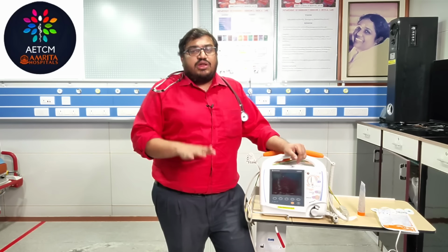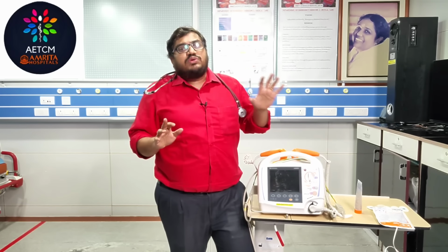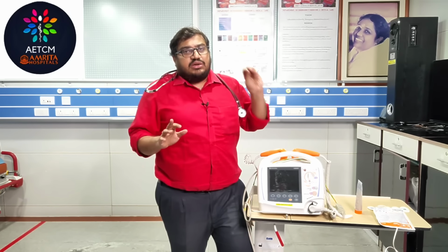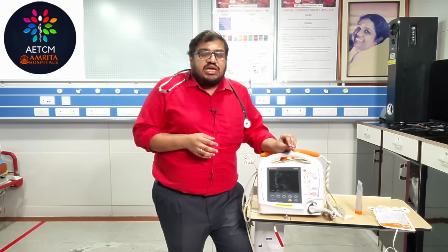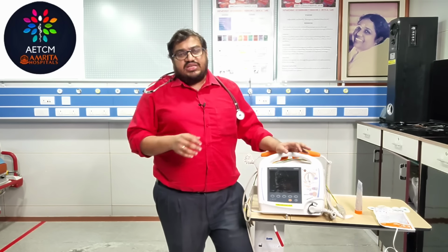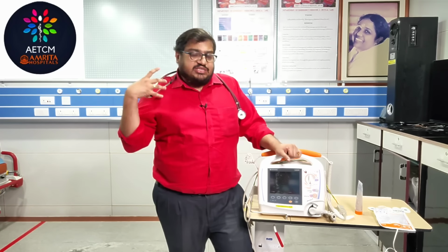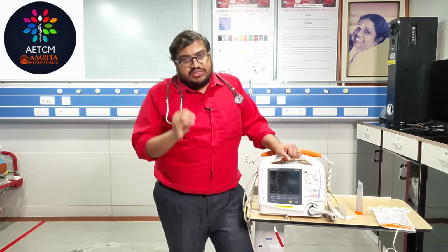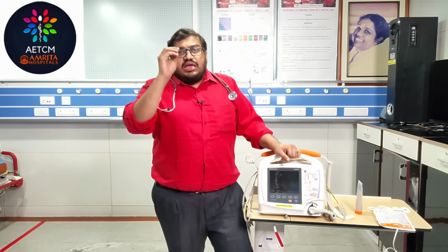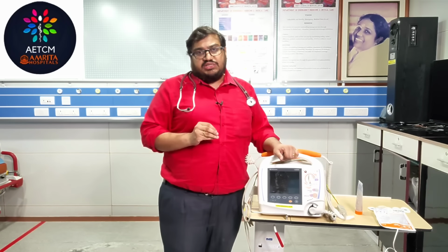We are discussing here a new onset tachycardia where he has come unstable. You will be cardioverting the patient. So cardioversion, remember, you use for an unstable tachyarrhythmia or an arrhythmia refractory to your drugs. That is an indication for your cardioversion. As I told, consent, explaining the procedure to the patient, and procedural sedation are mandatory. And here we select the smallest possible energy to start with.